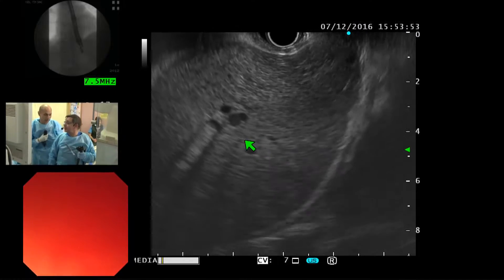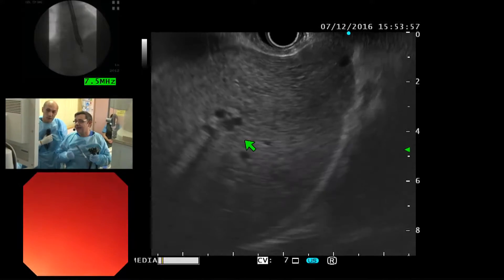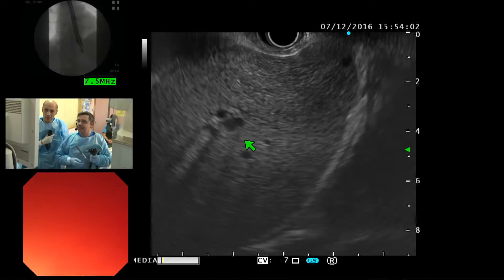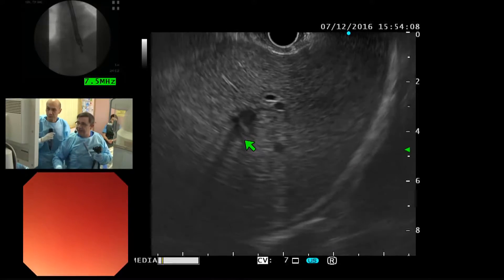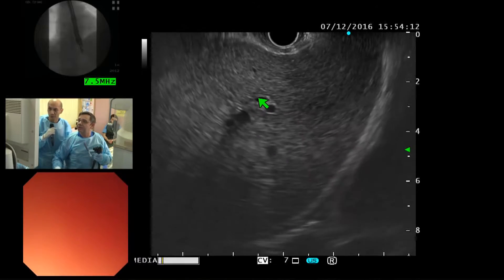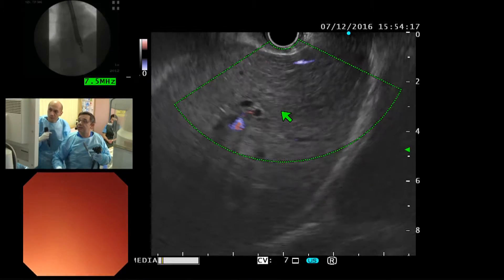This is a very challenging case because of course there is bile leakage — it's like a disconnected liver, not pancreatic duct. You see that we have no dilatation of the duct; this is a very small duct. I think this is the dilated duct — I think it's about one millimeter. I will put Doppler just to be sure.